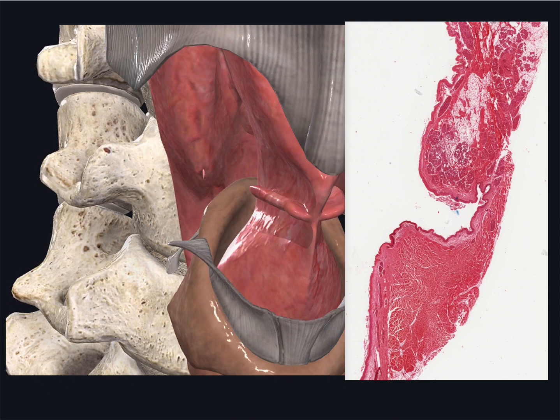In the previous section, the larynx was likened to a box. Running back to front, along the side walls of this box are two paired ridges of tissue, the vocal folds or vocal cords, separated by an elongated recess called the ventricle. The lower ridge or fold is the true vocal cord. Above it, and above the ventricle, is the so-called ventricular fold or false vocal cord.